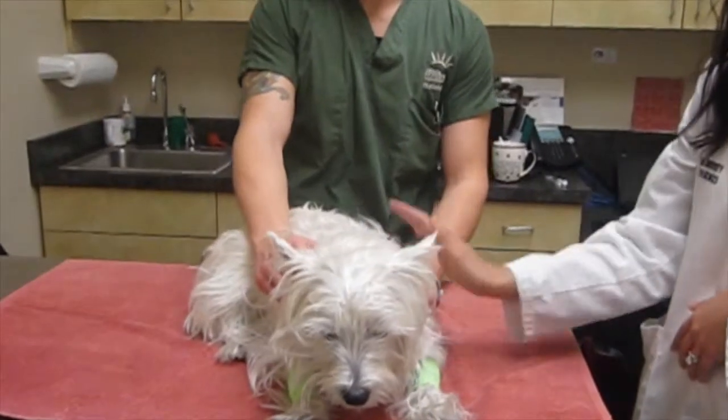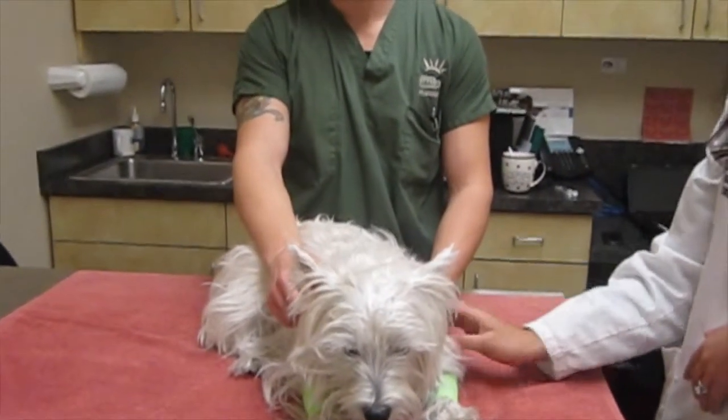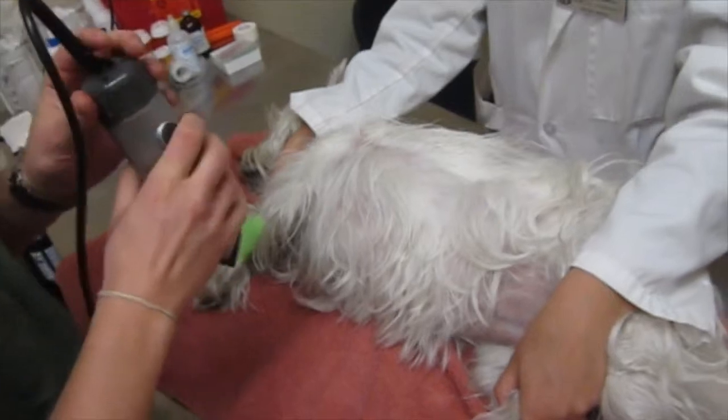Once she's a little bit more relaxed, we'll lay her on her side, and then we'll clip a little rectangle on her side and get ready for the allergy test. Now Willow is sedated, and we're going to clip a small rectangle right on her side.